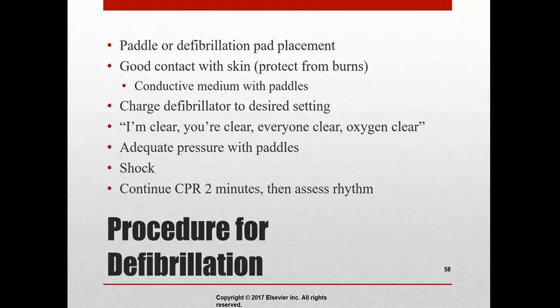We want to charge the defibrillator to the desired setting. And then it's I'm clear, you're clear, everyone clear, oxygen clear. If we have the paddles, we want to make sure that there's adequate pressure. If the pads are on, make sure when you stick them on that they're on really, really good. We shock, and then we continue CPR for 2 minutes, and then we assess our rhythm again. So really, it's just a standardized approach for defib.